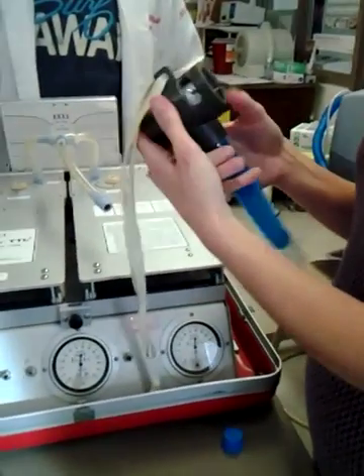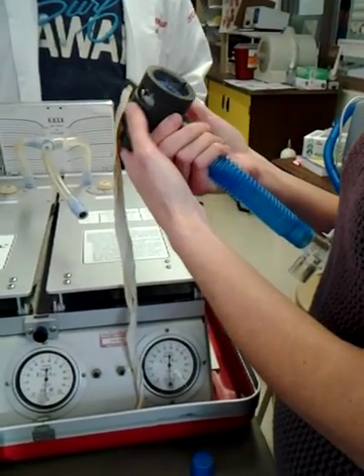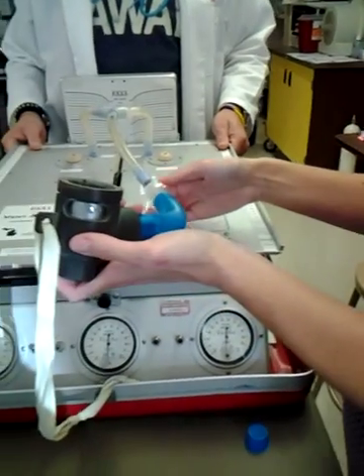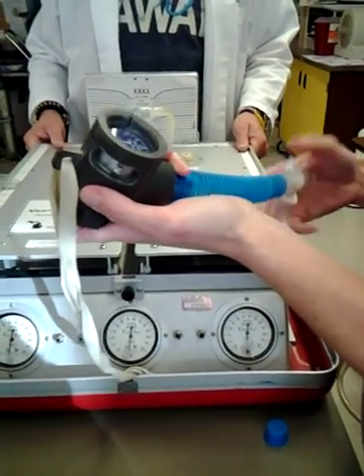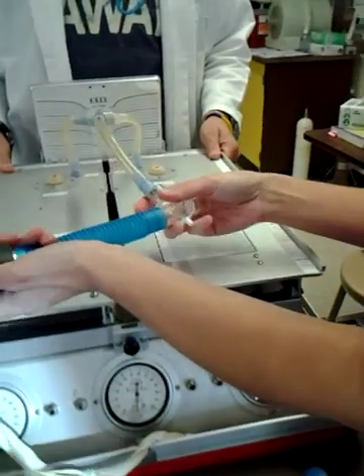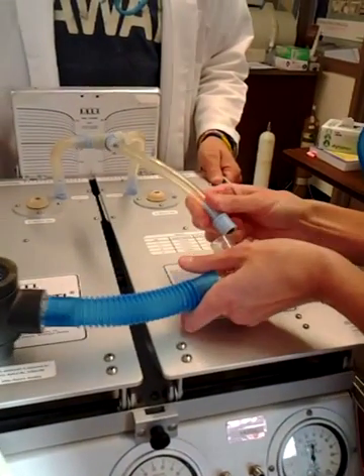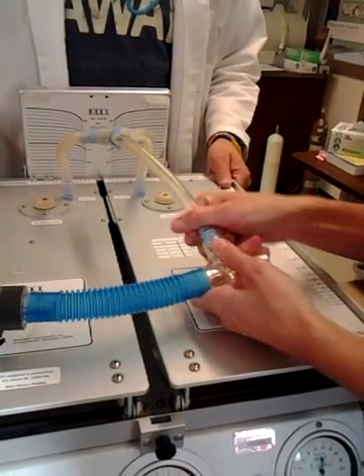I reset it, and then you have to watch the clock and count your respiratory rate as well, right.